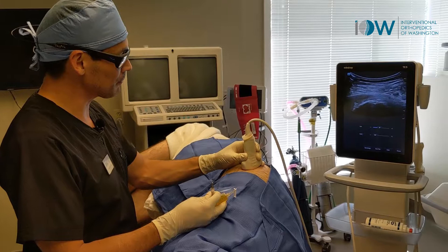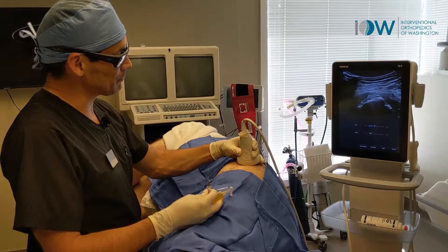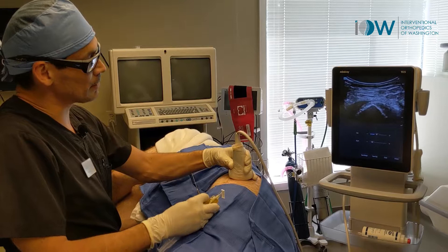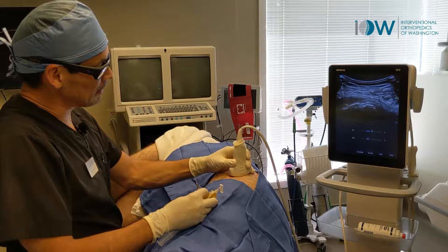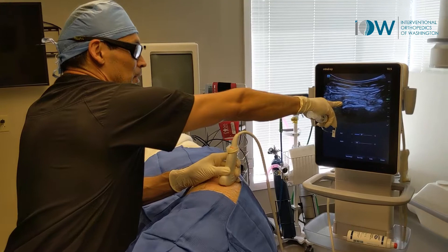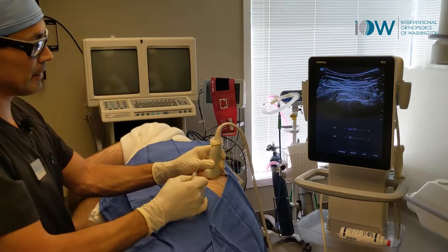We're looking here at the lateral femur and we can see that the tendons attach both on the left and the right side of that image where that trochanter is. We're going to take this angle toward glute medius, and that's where you start to see all that pathology. It really reveals itself in this irregularity, this hyperechoic calcified tendon with enthesophytes. We're going to work on treating that today with some barbotage and lavage followed by a PRP.